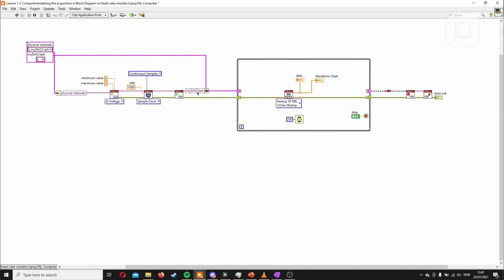So we'll just copy them from here because we're lazy. And laziness is not a bad thing. And we'll change to this one. There you go, in here, here. Move a little bit this one, and then boom. And we'll start it with here. It's important that the output comes from this one and not this one, or else it won't take this data forward. So I could have made this mistake and just connected it from here. And you will see no error, but then any data pushed in here will just be discarded. There you go, and we'll copy this one here, and boom, boom. I have auto connect on when it's closed. This can be annoying, but in this circumstance, it wasn't.